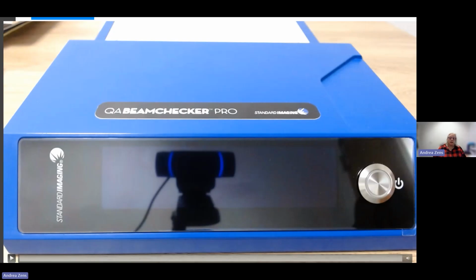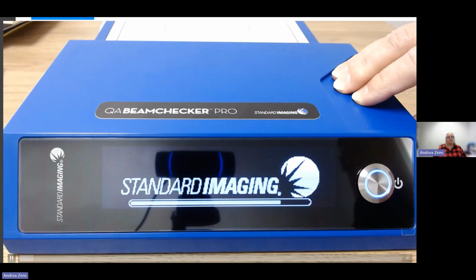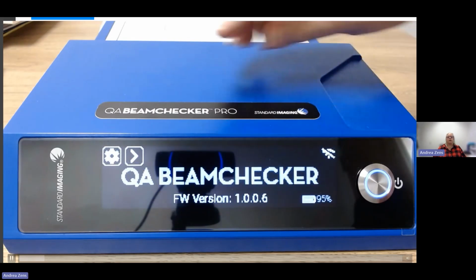So I made a little video. It isn't professional, it's just little old me doing it. But let's take a look, because it's the best way to show you what it is. Turn on the device and it goes through a power on self-test. That's what it's doing there, to make sure everything within the device is working properly.